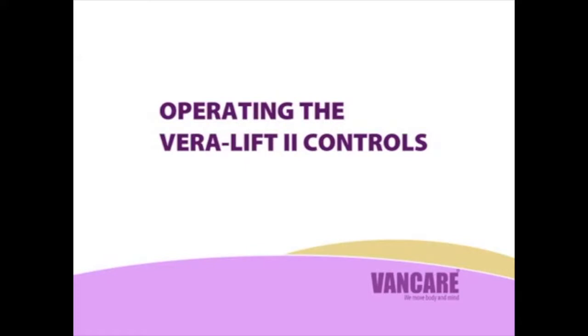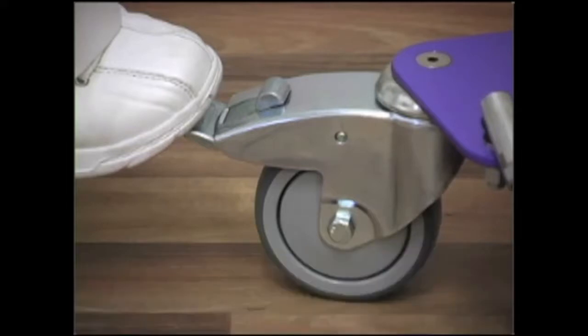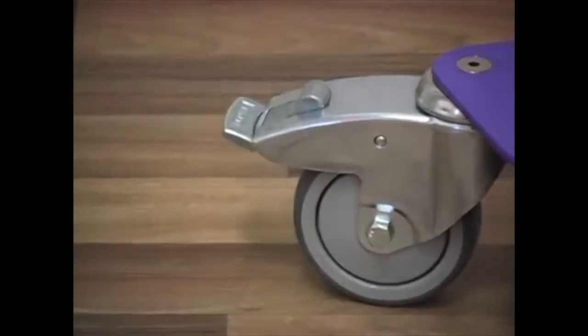Operating the Vera Lift 2 controls. Locking the brakes: The Vera 2 is equipped with rear caster brakes. To lock the brakes, press on the back of the brake tab. To release the brakes, press on the button on the top of the brake as shown.